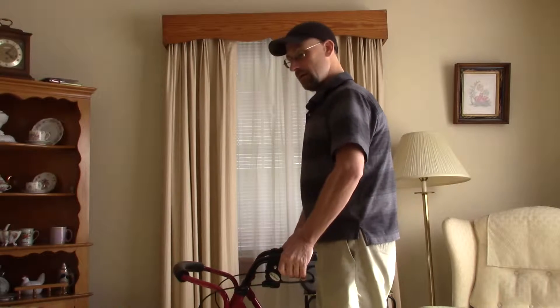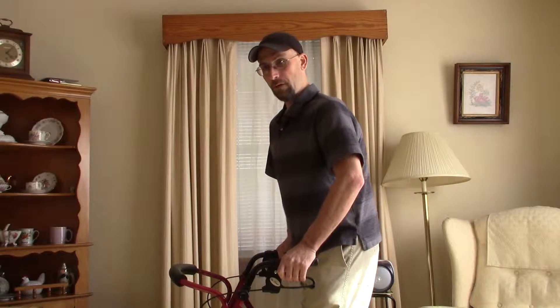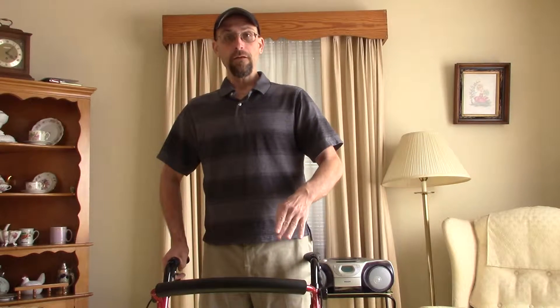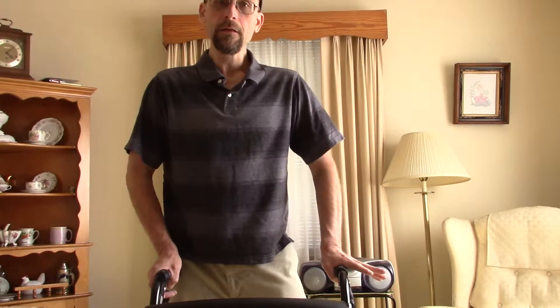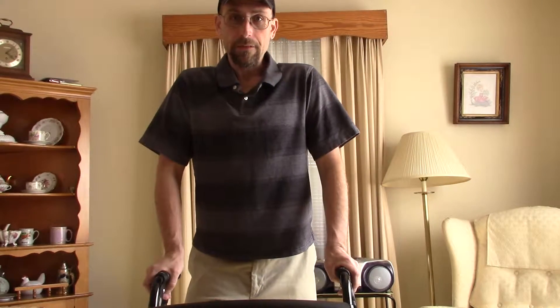Standing up straight with a slightly bent elbow on each side, you take your weaker foot and put it forward, then follow with your stronger foot. If both feet are weak, just use whichever you're more comfortable with, following one foot with the other carefully.